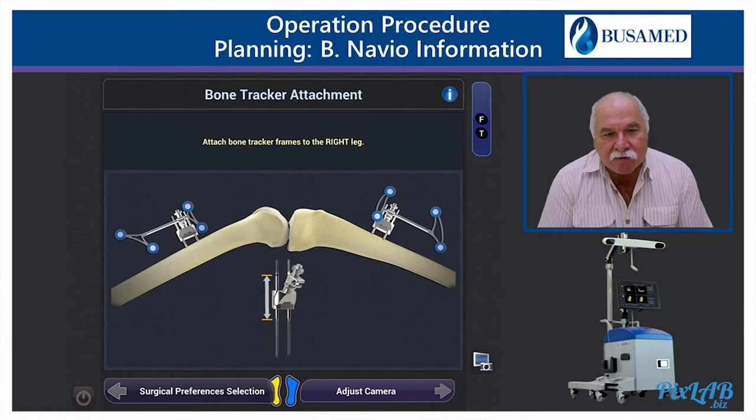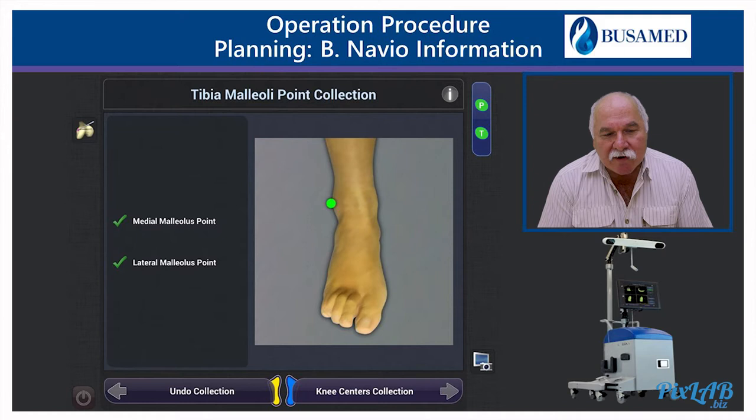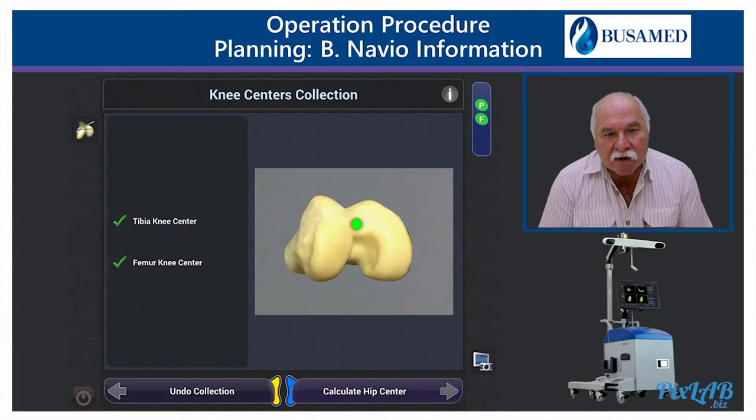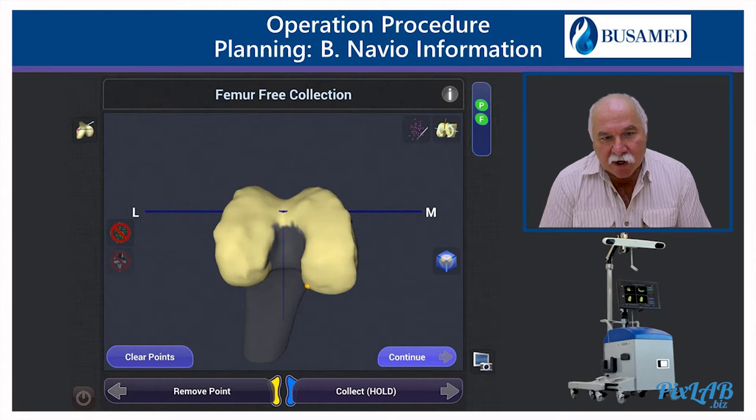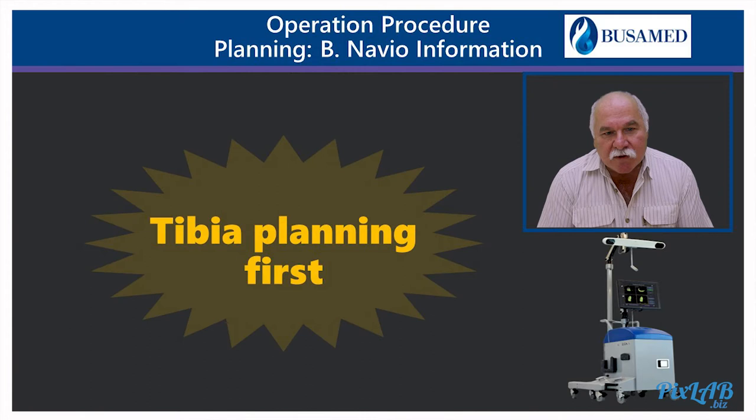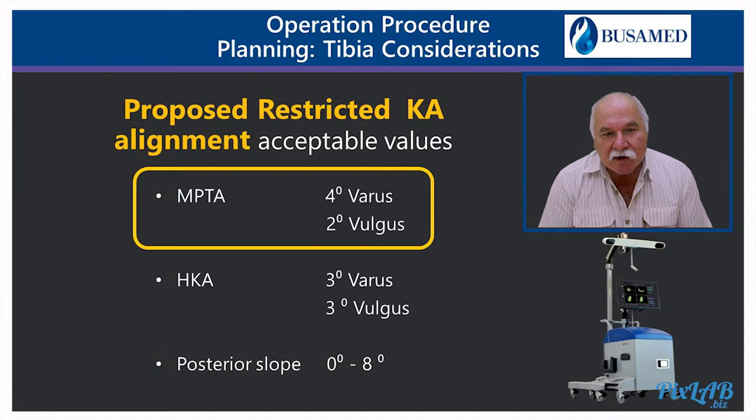Now we collect the Navio information. We have our trackers in position. We have our distal ankle, medial and lateral malleolus points, and the center of the femur. We have our hip center which we collected, and then we morphed or painted the femur as well as the tibia to get our 3D image.